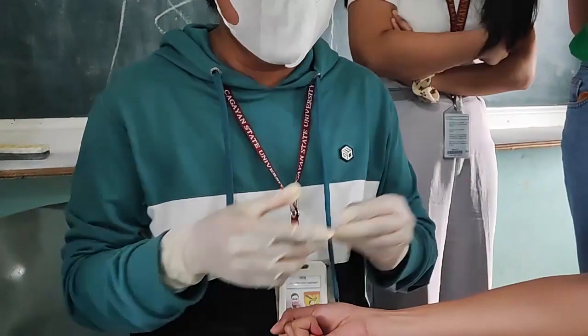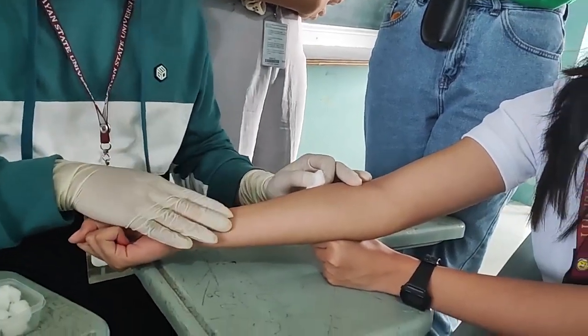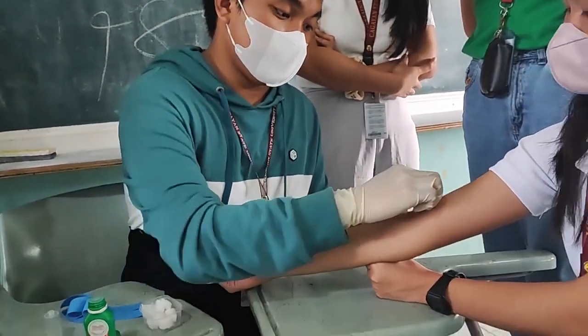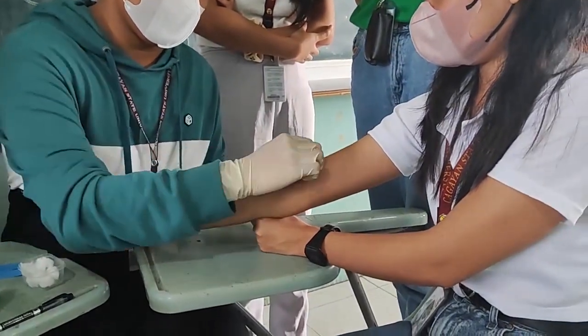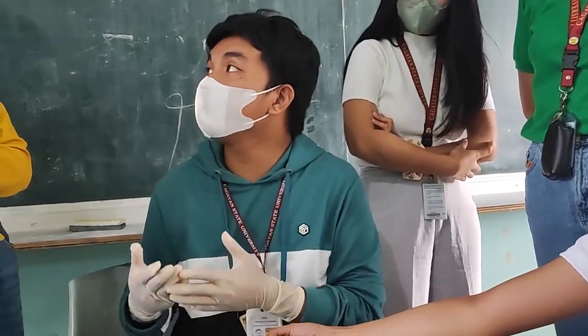So, ang next po na gagawin ko is to i-clean po yung site na kung saan hindi niya po masyadong ginagamit. Kunwari, ito pong site na to is hindi naman po siya nakuha sa aksidente or hindi niya naman po masyadong ginagamit. Ito ang right side niya. Then, dito po ako kukuha. Then, I'm going to sanitize it po. And then while it's air drying po, i-prepare ko po yung mga gamit na kailangan po.